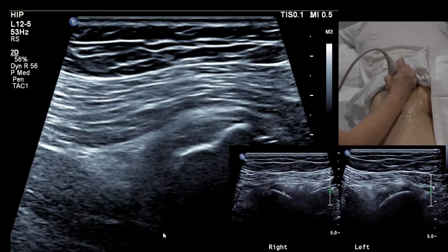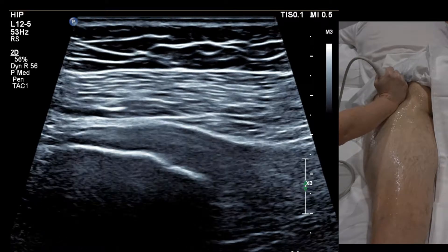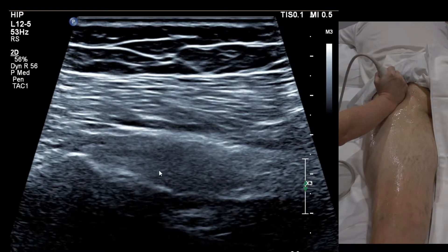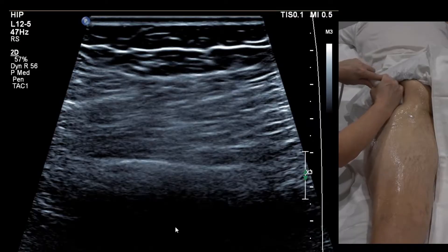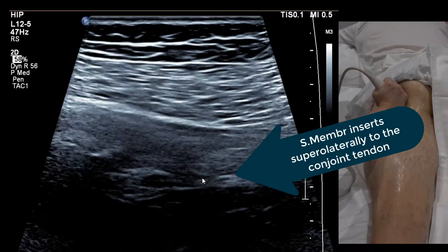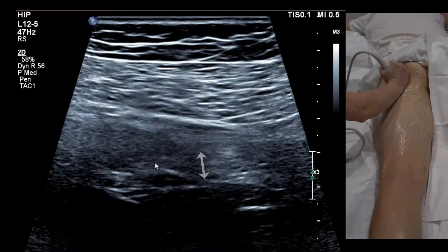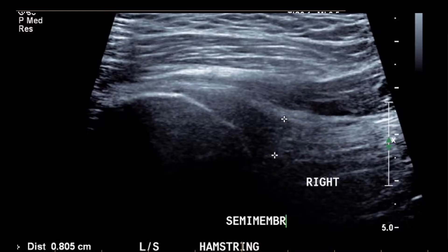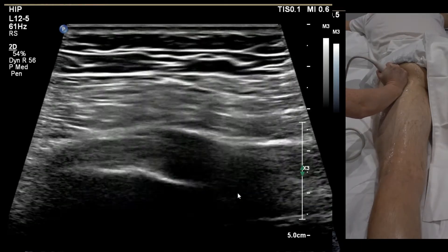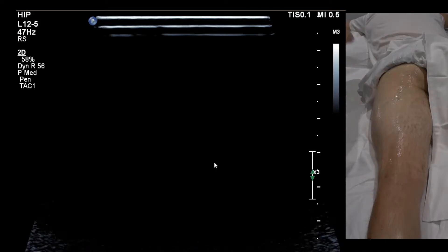In longitudinal you can sometimes see semimembranosis. More medially it's definitely conjoint tendon; coming laterally and angling with more pressure, you can just start to see semimembranosis tendon fibres — one tendon on top ending at a white line, with semimem fibres underneath. If we ask the patient to flex the knee, lifting the shin slightly off the table, it pulls the tendon tight, making conjoint tendon on top and semimembranosis fibres below more visible. As they dive really deep, it's difficult to image with just a 12-5 probe.